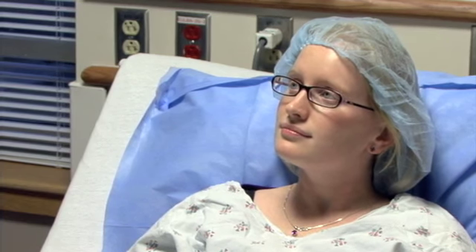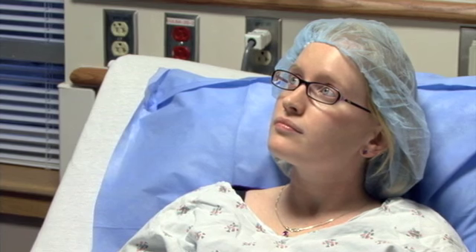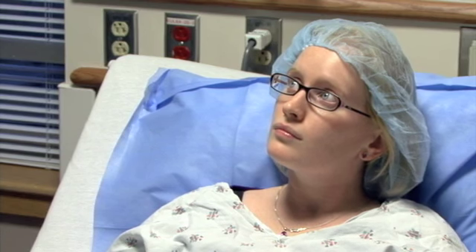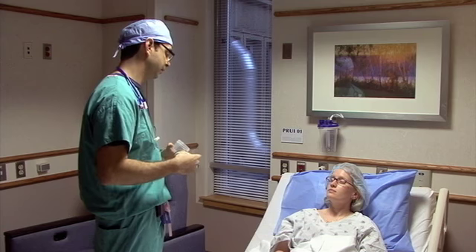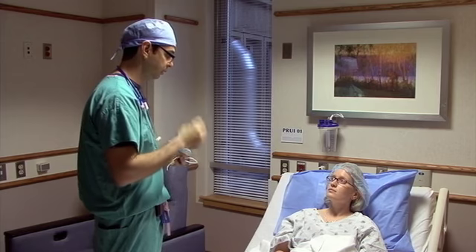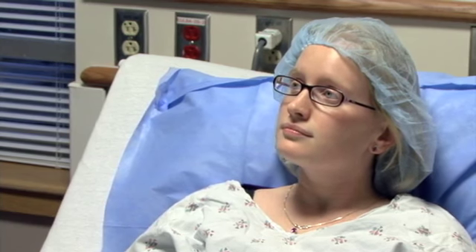So the first step is we give you some medication through your IV, 2 medications. One is going to take away pain and the second one is just going to relax you. Once we have the medication on board, we'll use an ultrasound machine to locate the large vein in your neck, the internal jugular vein. When we find that vein, we'll use some local anesthetic to numb up the skin overlying the vein, and then we'll stick a needle into that vein. Through that needle, we'll thread a wire that'll go down the vein towards your heart. Once we've verified that it's in the right place in your heart, we'll take the needle off and put a catheter in over that wire just to hold the place.